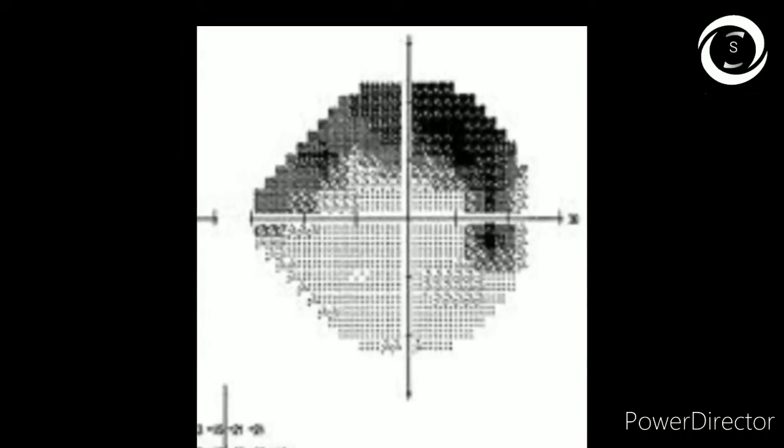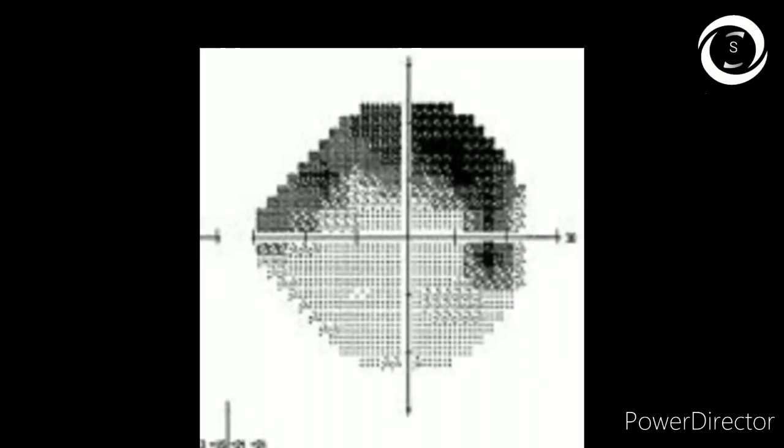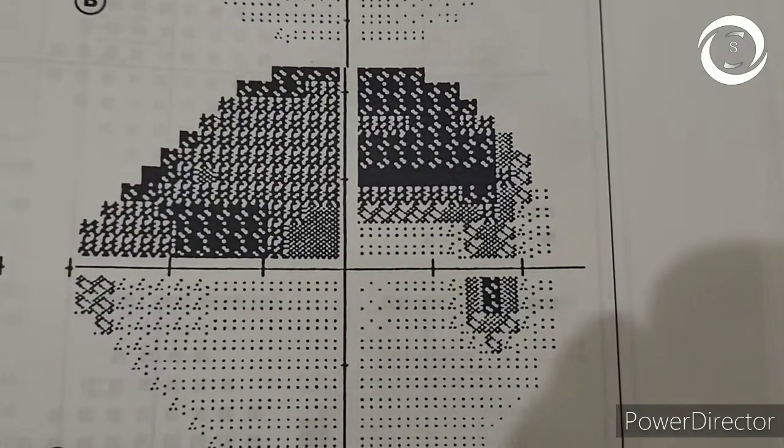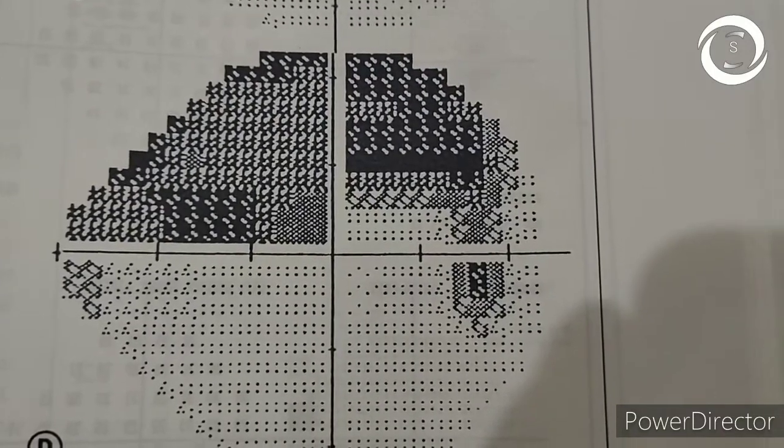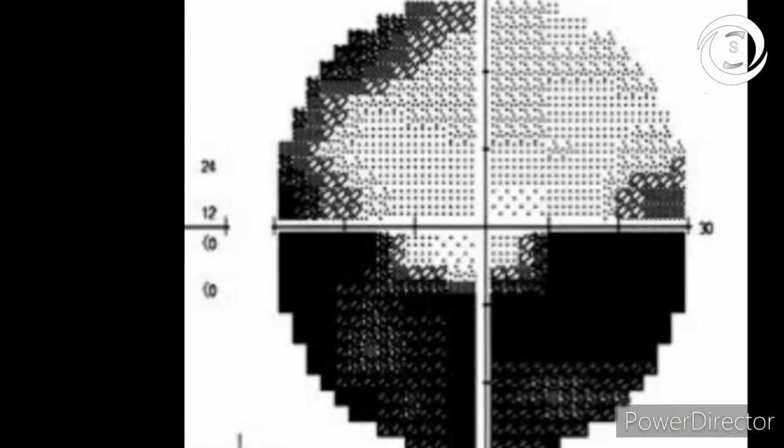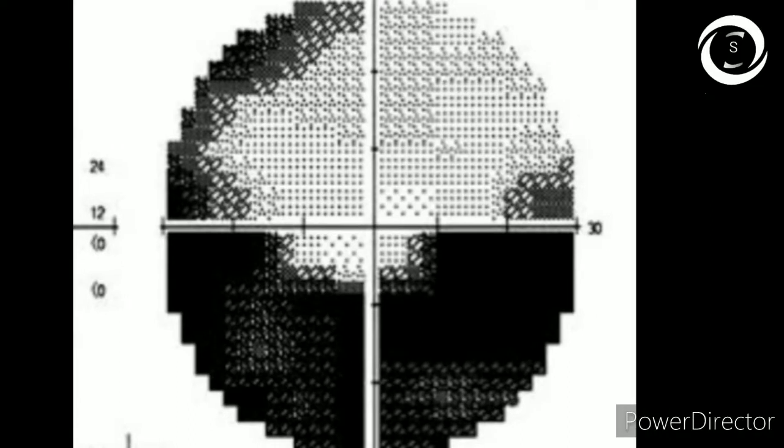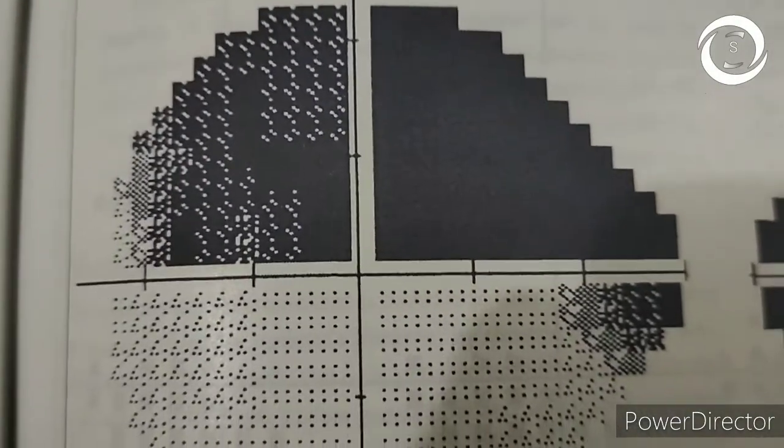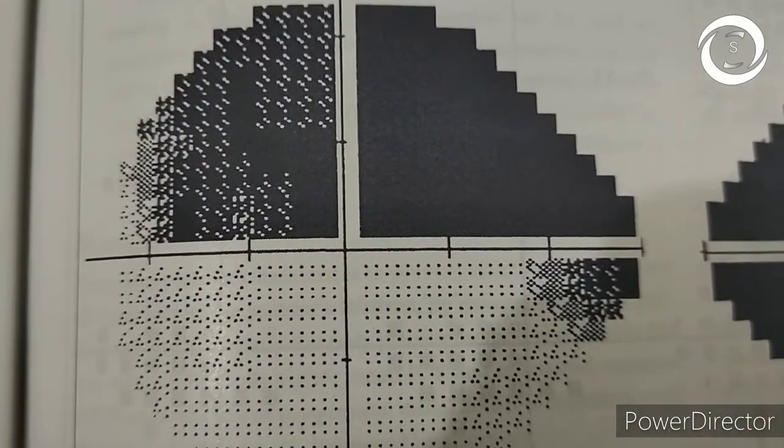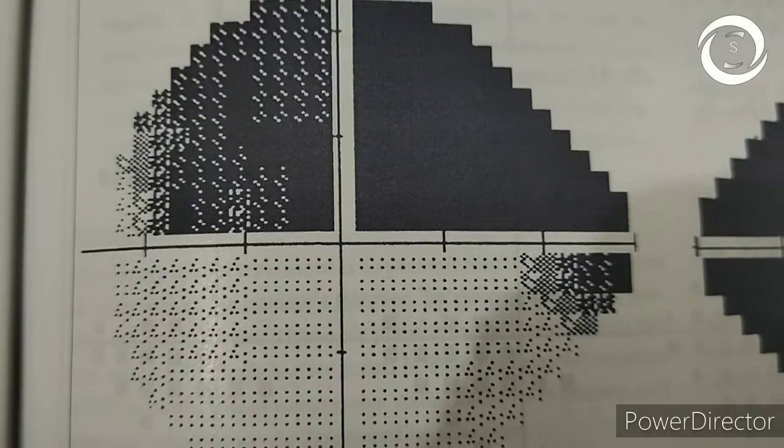As visual field defects progress in glaucoma, more and more fibers around the arcuate are involved, resulting in horizontal hemifield defect or altitudinal scotoma. Look at the inferior altitudinal scotoma in this patient's visual fields, and now superior altitudinal scotoma in the other patient's eye. That's how altitudinal defects are seen respecting the horizontal meridian.